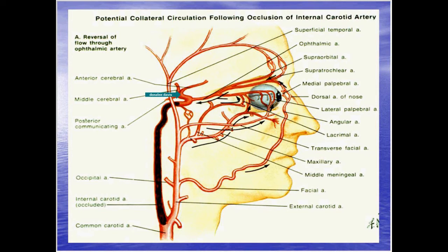I have seen more than a handful of physicians that have endarterectomized an external carotid artery here. You know, normally they don't touch them. If there's disease in that external, the doctors are like, so what? Who cares? You know, you're going to lose feeling in your cheek. They don't touch them. They'll clean out the internal but not the external. But here's the caveat. If you've got a blocked internal and that external has disease in it, and they know darn well that's the only way that brain is being protected, they will clean out the external carotid artery. Again, it doesn't happen often, but it does happen.